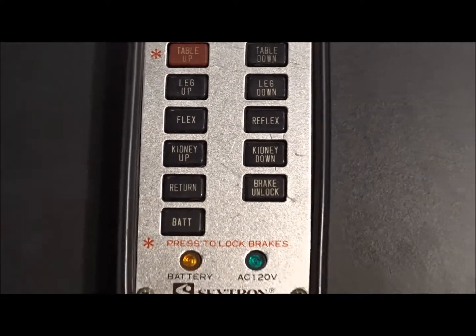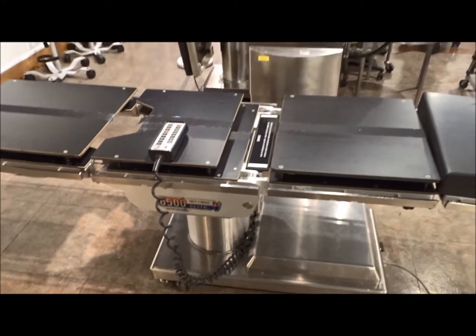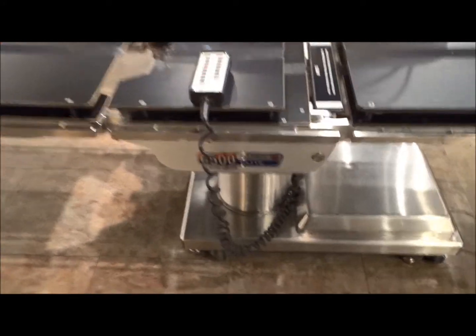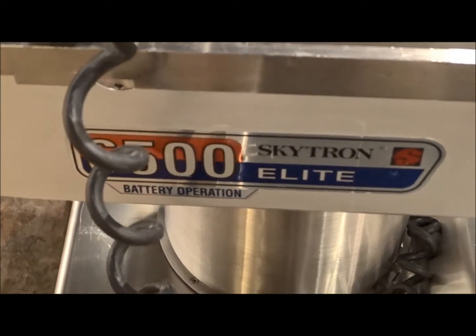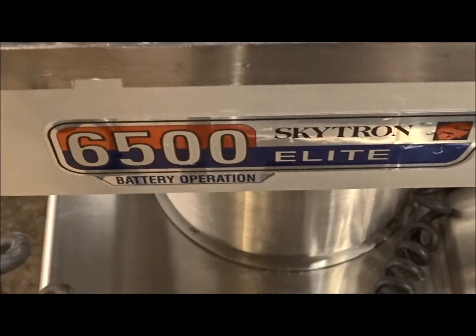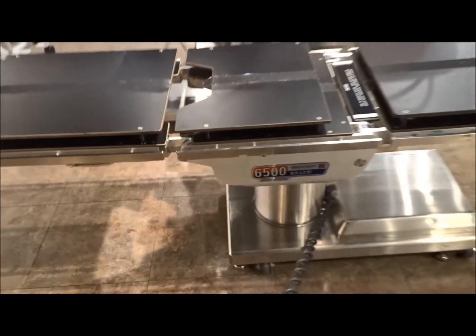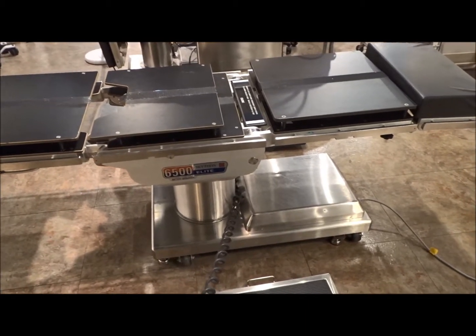We are at Hospital Direct Medical, iMedical, and we are looking at surgical tables. Right now we're looking at the Skytron 6500 Elite, which is a very popular table that comes out in the used refurbished market. We've got these in stock right now, and this is going to perform a host of functions with a lot of functionality for general medicine.